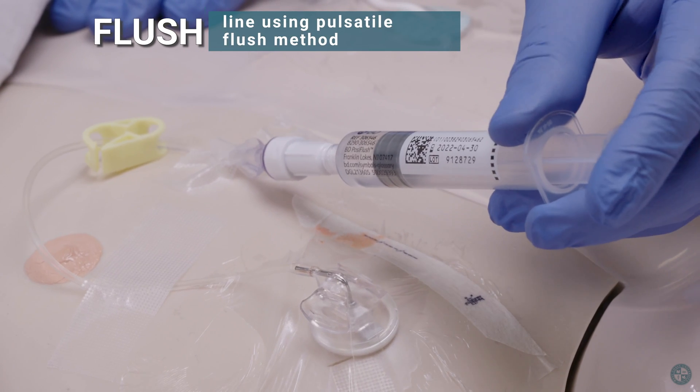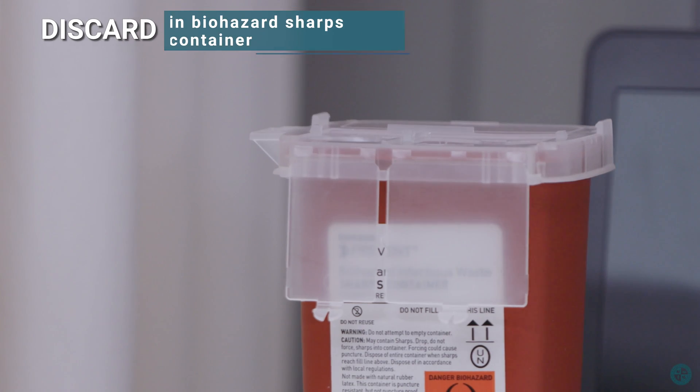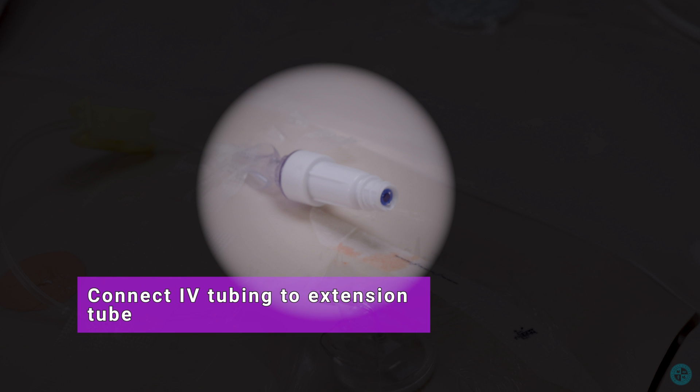Flush the line with 10 milliliter normal saline using the pulsatile flush method. Discard in biohazard sharps container. Connect a new access cap if appropriate, then connect IV tubing to the extension tube.